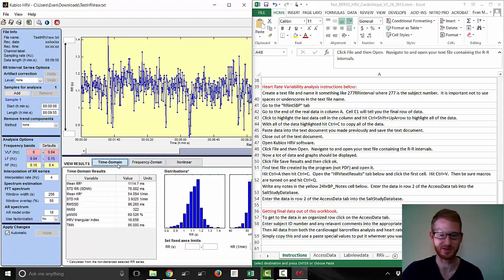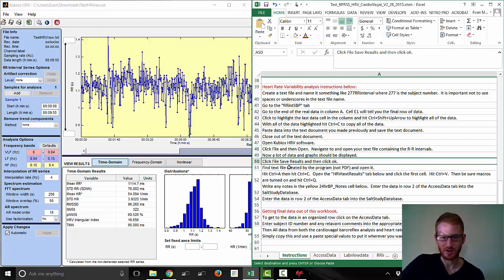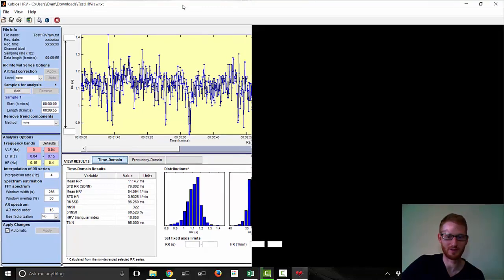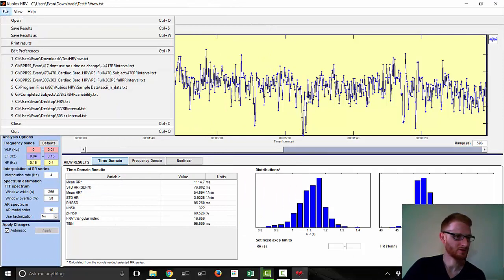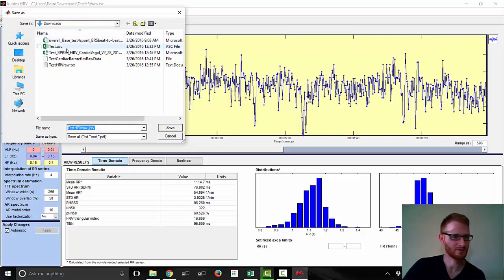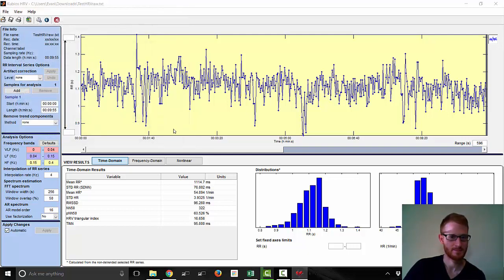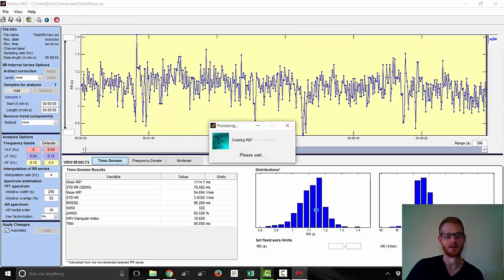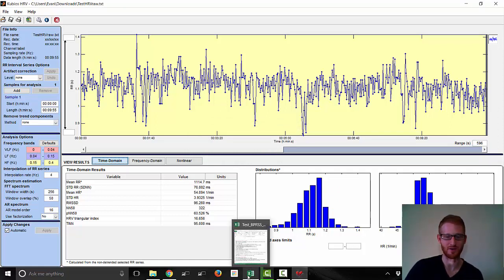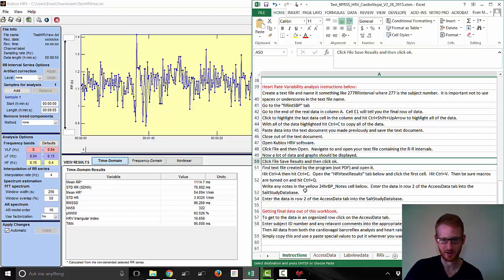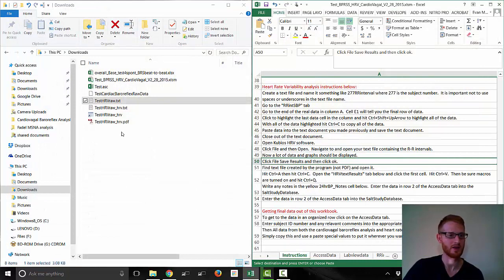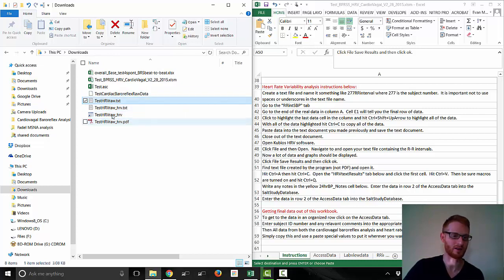We're just going to save all this data. Click Save Results, and then click OK. So where does it say Save Results? I'm going to assume we can do it here. Yeah, so File, Save Results, brings up a dialog box asking where to save it. Let's just put it in the same folder with everything else and hit Save. This might take a second. So I think it saved several files. We're not going to need all of them, but you can always save all of them just so you have it for later on. And I think now we can close out of Kubios. That's all we need to do with Kubios.